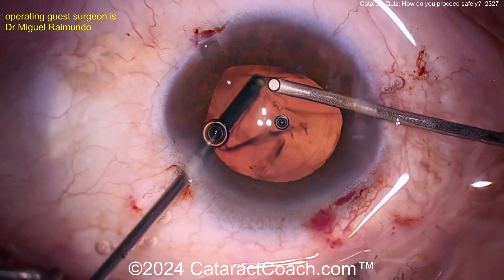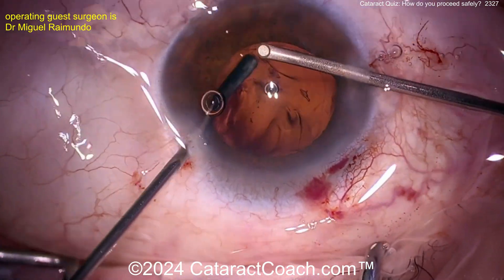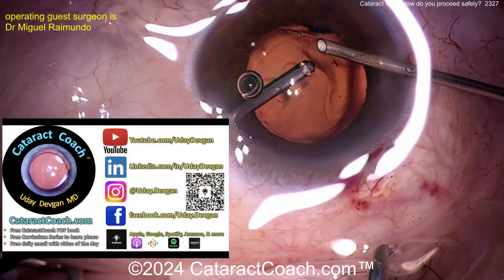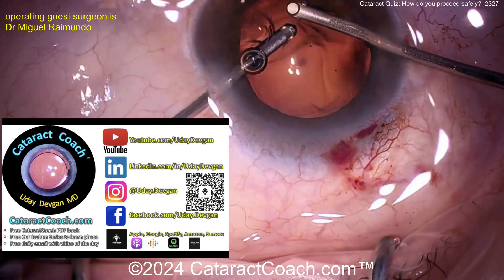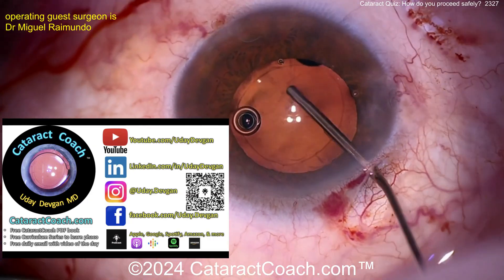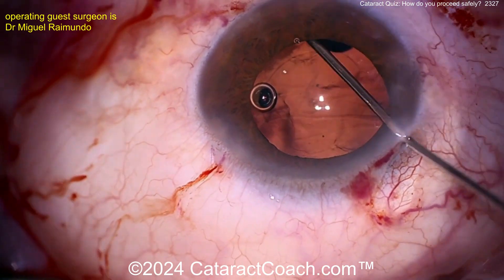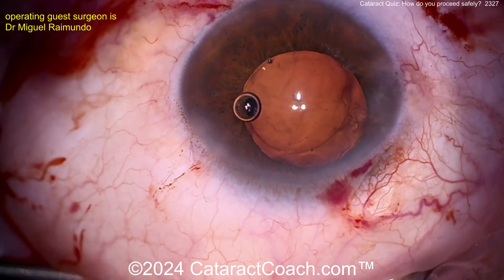You've got to tell the referring doctor: why did you put a needle in the lens capsule? Go to cataractcoach.com — lots of free material plus the CataractCoach podcast, all about ophthalmology. Back to the case: viscoelastic filling up the bag, it looks pretty good, all the cortex is out — beautiful job, doctor, very nicely done.